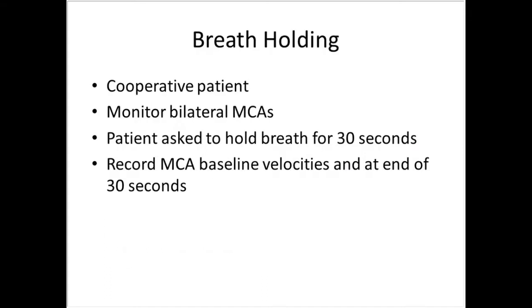Now, in order to do breath holding, you do need a cooperative patient. You monitor the bilateral middle cerebral arteries. The patient is asked to hold their breath for 30 seconds. We record the MCA baseline velocities at the beginning of the study and then at the end of the 30 seconds.